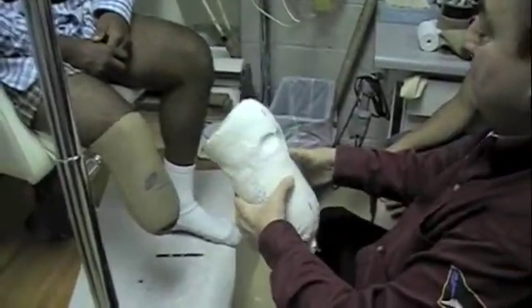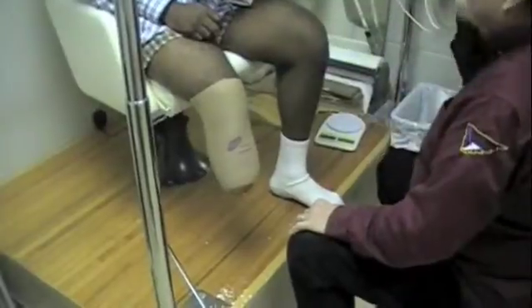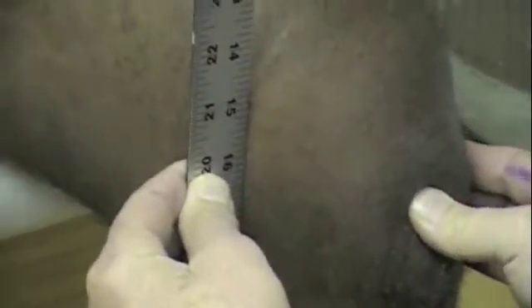And that's you inside with all the details. Now we're going to take a few measurements of the other side so we know how tall to build it and all that stuff. I'm looking at — right here is the patellar tendon. What would you say for a length? I'd say 19 and a half. 30 here. Length of foot: 30 cm.